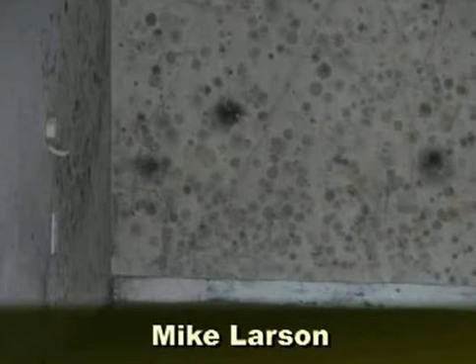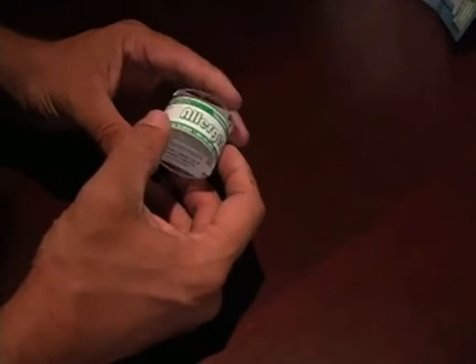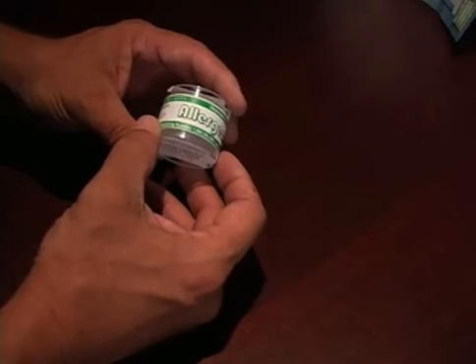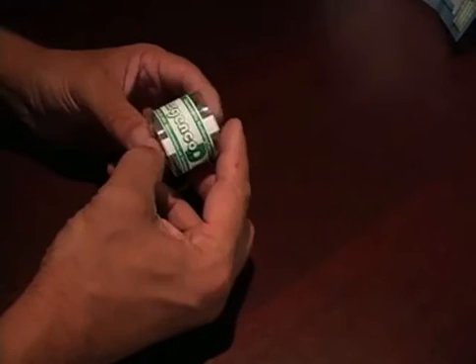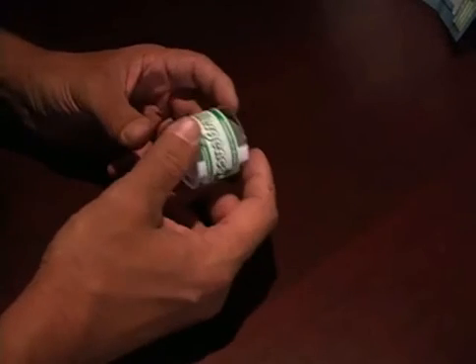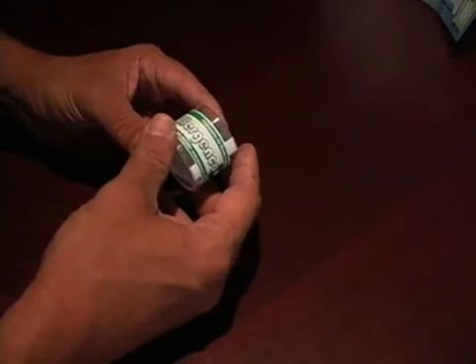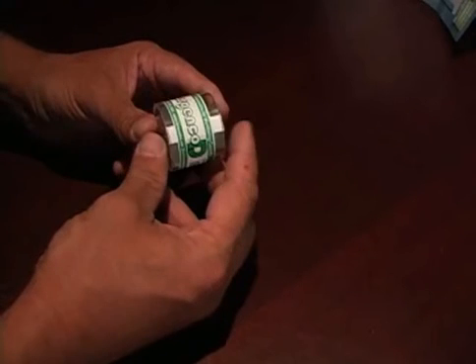Let's take a look at a sampling device here. It's used to collect bioaerosols and aeroallergens for quantitative analysis of mold spores, pollen, skin fragments, insects, combustion particles, environmental dust, construction dusts, and airborne particulates. It's designed to operate at a standard flow rate of 15 liters per minute. Pump calibration should be conducted prior to the start of the sampling protocol.